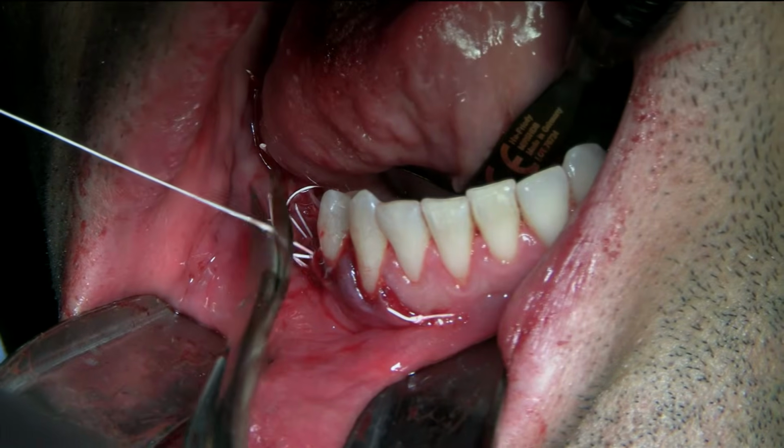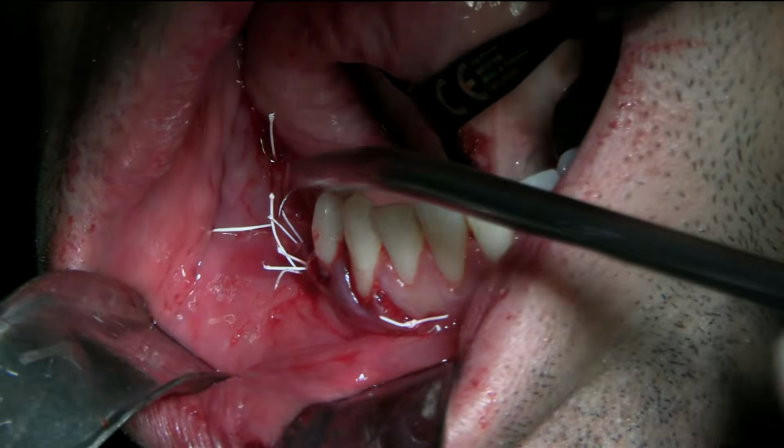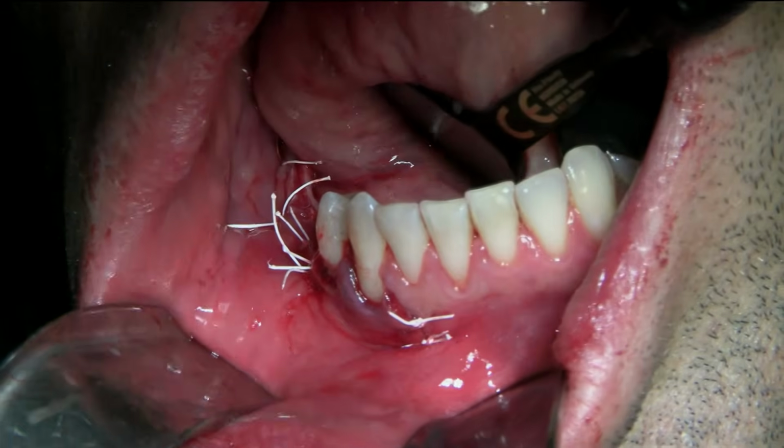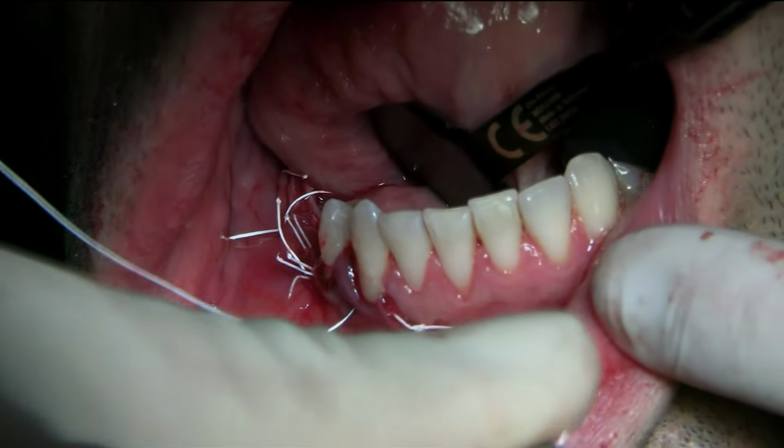You've got to go with another scissor, because you're left-handed, it makes a difference. Try this one next. Okay, now I'm going to take the papilla between the teeth.